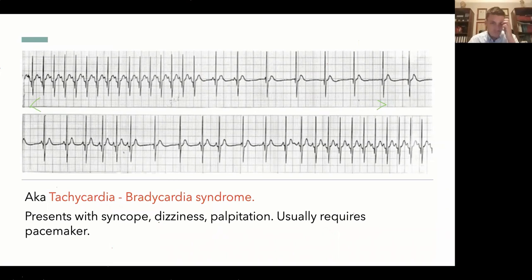So, we see that we have alternating tachycardia and bradycardia. That means that something is not firing rapidly, and this is very tiring for the patient and the patient's heart at the same time, okay? I think this makes sense. It's tiring because imagine the heart cannot work as a pump properly. Imagine doing the bike doing this, then doing very slow. It's nonsense. You cannot actually have a proper output if it works like this, no?